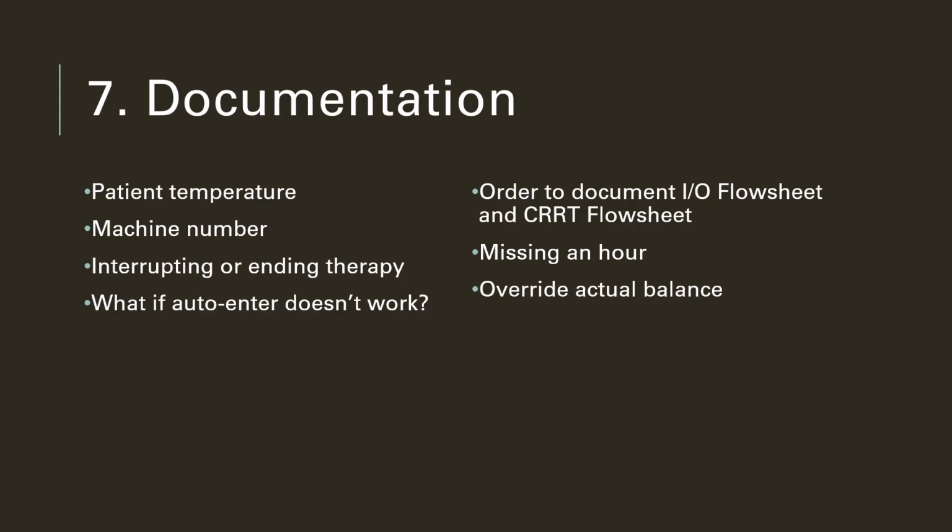It can also be used for errors on the flow sheet if a previous user has made a mistake, or for example if you forgot to chart a volume that happened earlier in the shift and you don't want to go back and rechart all those time columns, because you'd have to clear your I's and O's as well for it to work.